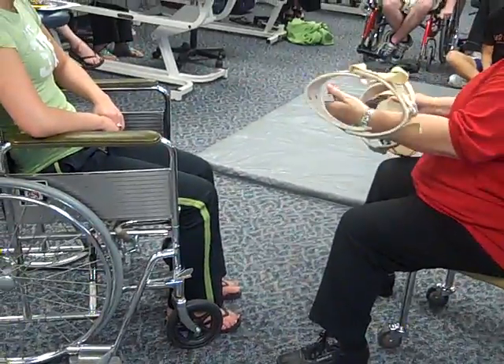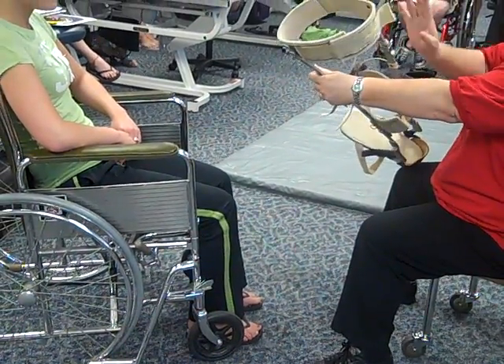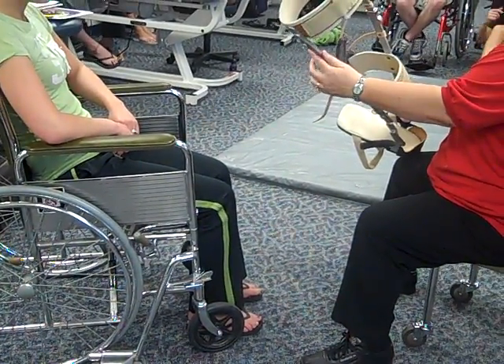So these are the full control braces. They could also be called a KAFO because they're going to control the knee, ankle, foot — that's the knee-ankle-foot orthosis, the brace. So, KAFO or full control braces.